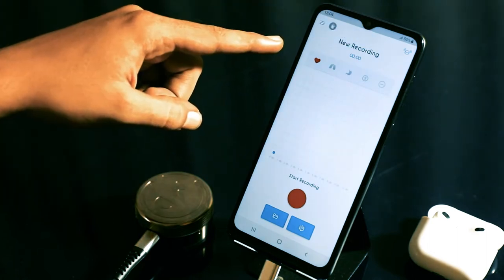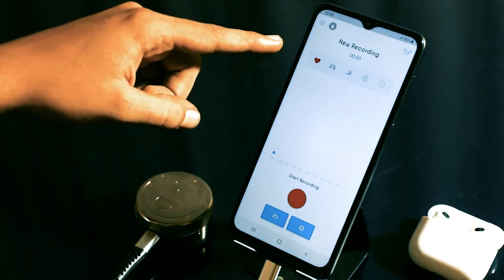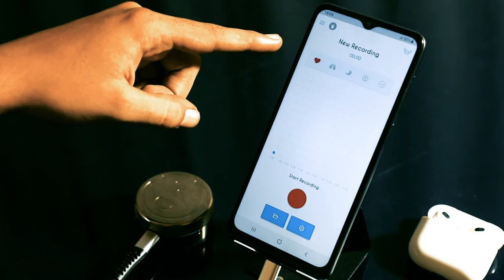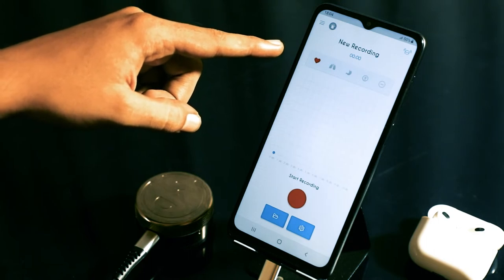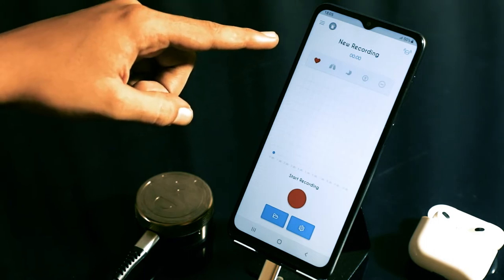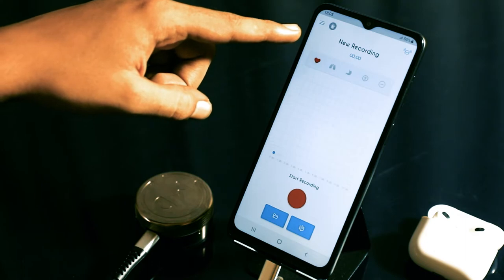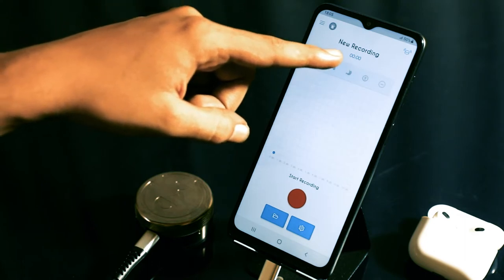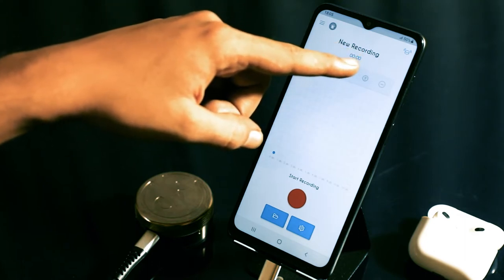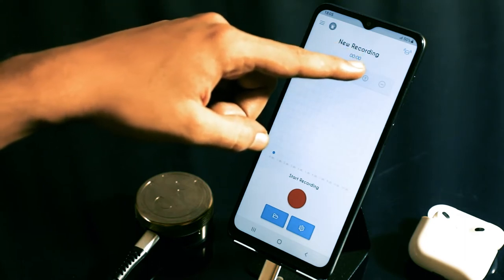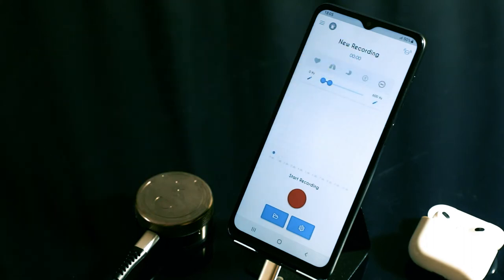Next up is the filter menu. On the Tal app, you can filter sounds that are coming from the device. You can filter for the heart, lungs, or bowel sounds. You can also choose to not have a filter or a custom filter.